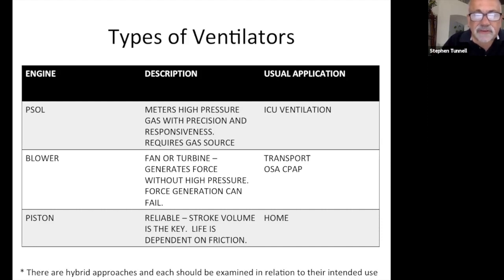In order to do that effectively, an ICU ventilator has to have three major functions. It has to be that therapeutic device I just referred to. It has to also provide monitoring, and it has to provide diagnostics. So a ventilator really is a platform at the bedside that's providing therapeutics, diagnostics, and monitoring. And a lot of people don't realize that.